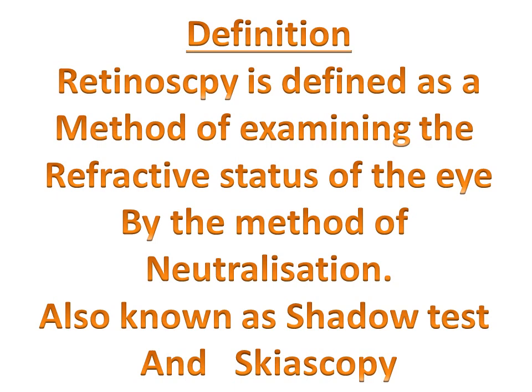Coming to the definition, retinoscopy is defined as a method of examining the refractive status of the eye by the method of neutralization. This procedure is also known as shadow test or skioscopy.